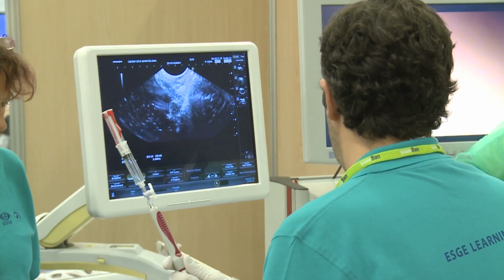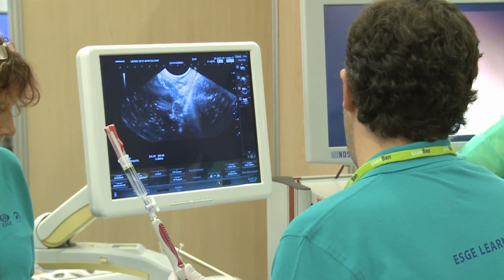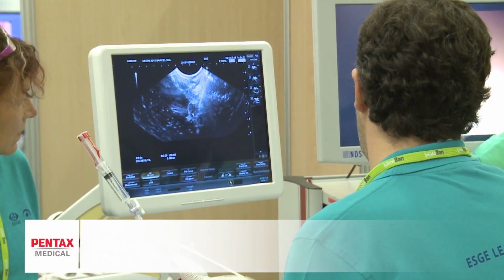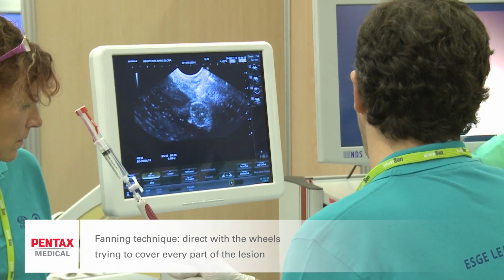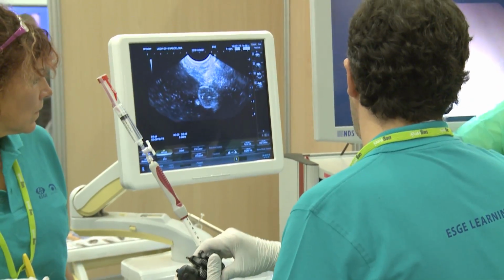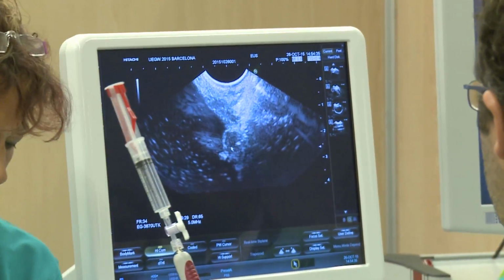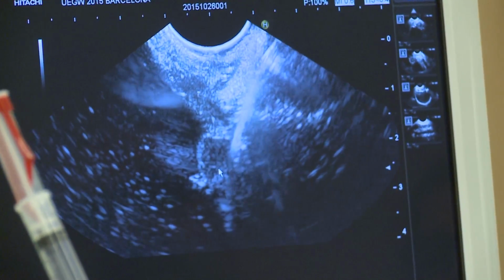And now it's to and fro movements. You need to go, and there are different tricks, okay? I like to do the fanning technique. The fanning technique is I direct with the wheels to try to cover every part of the lesion, okay? Multiple passes. How many passes to satisfy the pathologist? This depends on whether you have the pathologist or not.